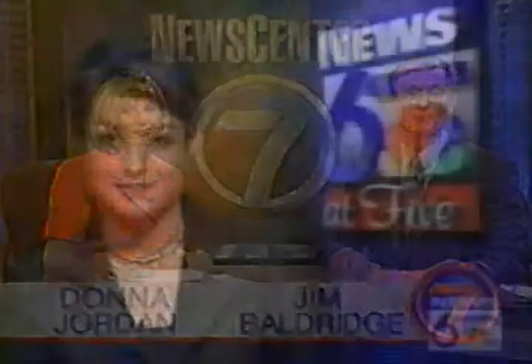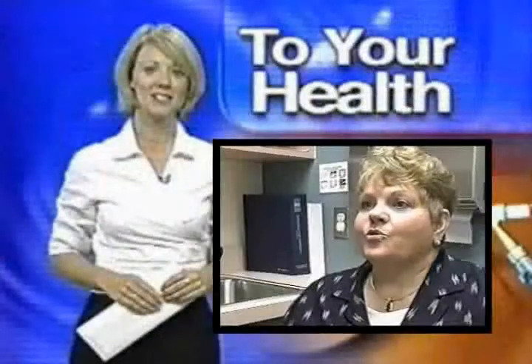I think it lets you get on with your life a lot faster. You preserve the breast, and instead of having, let's say, 37 external treatments to the breast, you have treatments over 5 days. Actually, we get 10 treatments, one twice a day, but it's over a period of 5 days instead of 7 weeks. You go twice a day for 5 days and you are done.